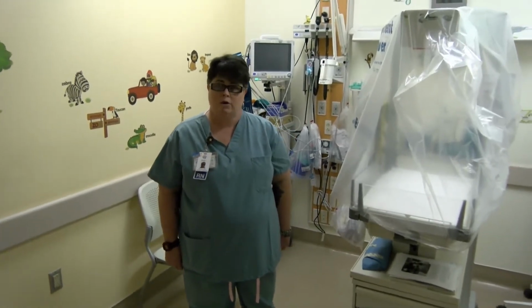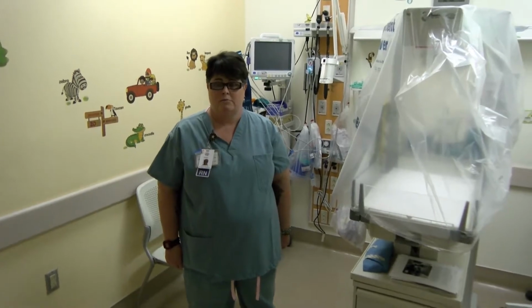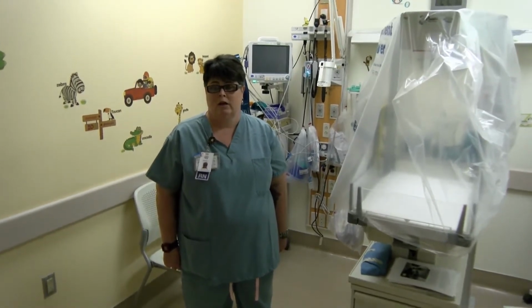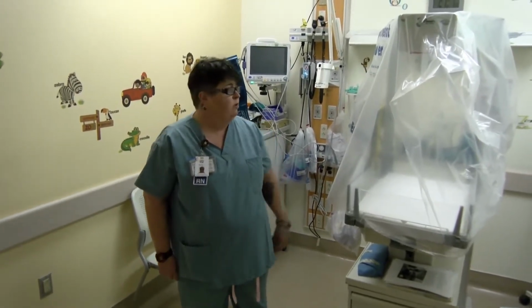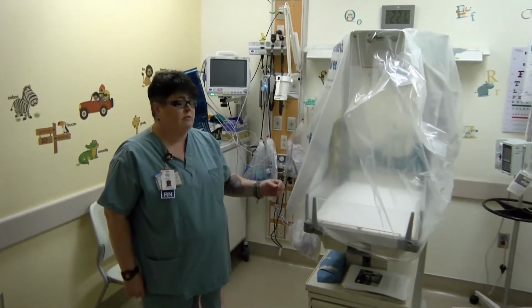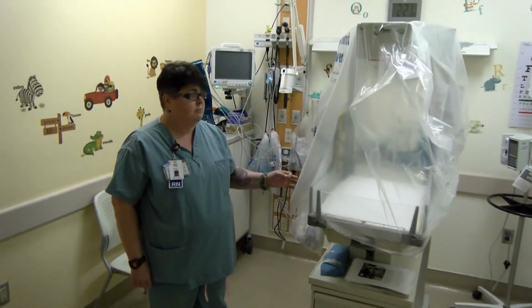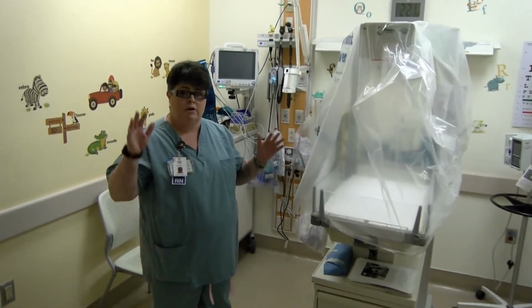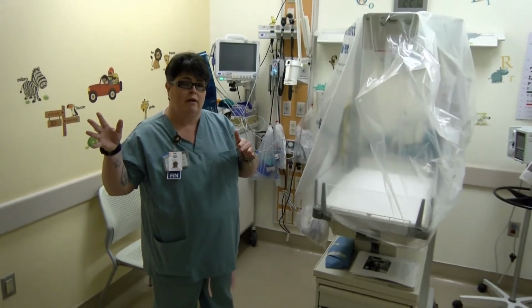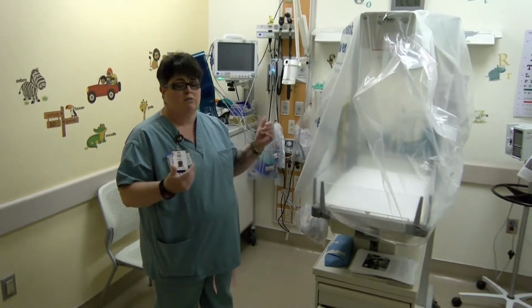I'm from the Copper Queen Emergency Room Department of Bisbee, Arizona, and today we'll be discussing the use of the Panda Warmer in the emergent delivery of a newborn. Each of our departments has a Panda Warmer. It is kept in the storage closet of each facility of Douglas and Bisbee. In Bisbee, the emergency delivery cart is outside of the storage room. In Douglas, it is stored inside the storage room.